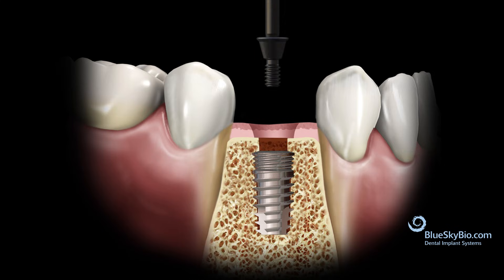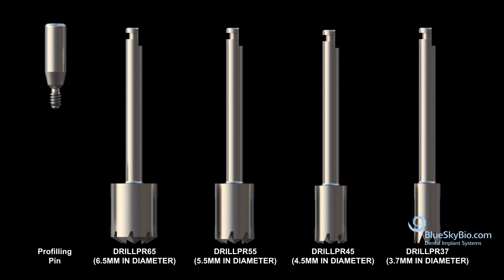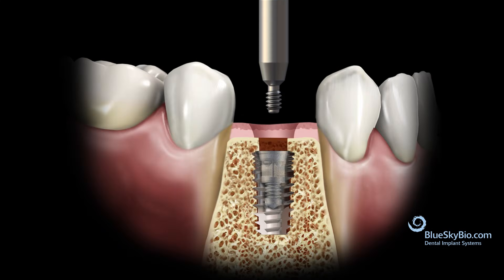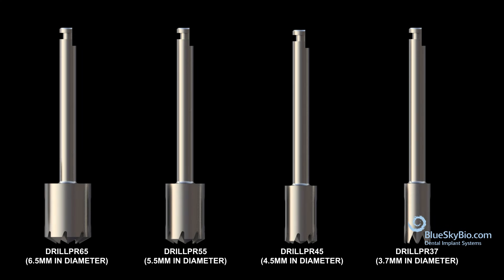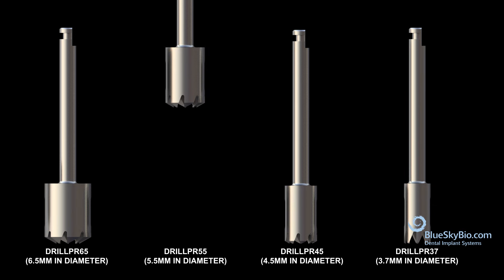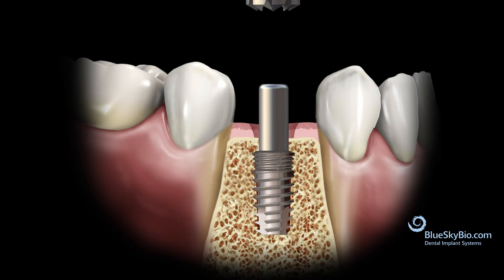To use the profiler kit, begin by removing the cover screw. Place the profiling pin into the implant and screw in until it's finger tight. Select the appropriate profiling drill from the kit that matches the size of the abutment or healing abutment that you are using.